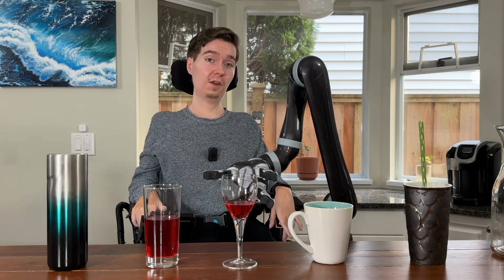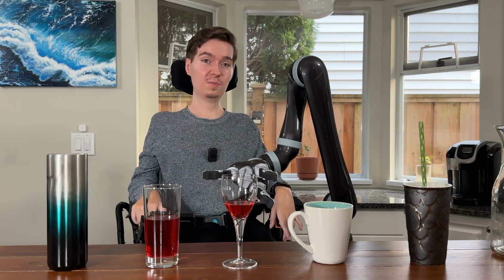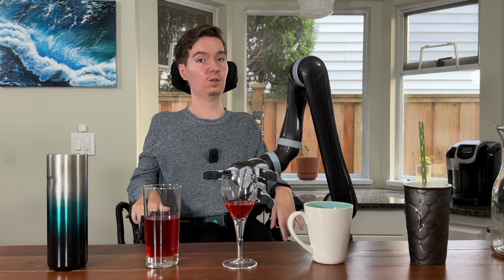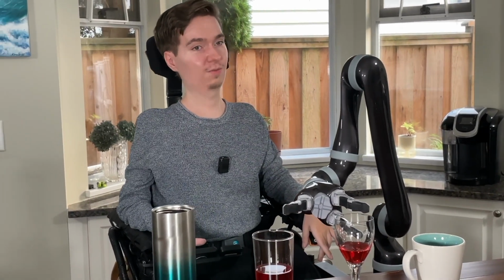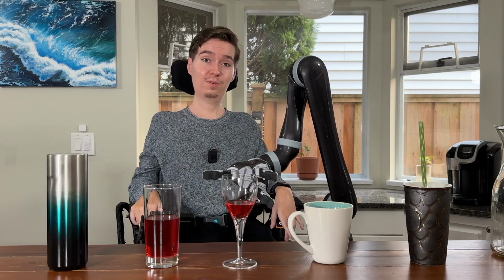A quick note on hot drinks. I would recommend waiting until you're very experienced with your Jaco before you start drinking your favorite teas and coffees. You absolutely can do it safely, but you're going to want to have a little bit of experience before you begin doing that, just to ensure that you're not spilling anything hot on yourself. So now you know everything you need to know to take your first drink with Jaco successfully.